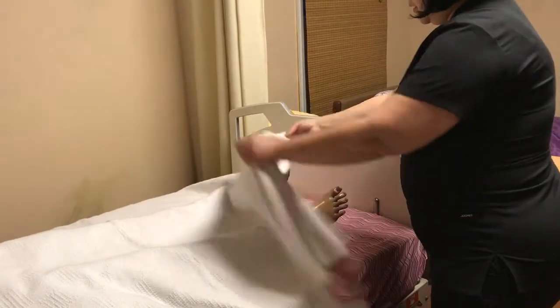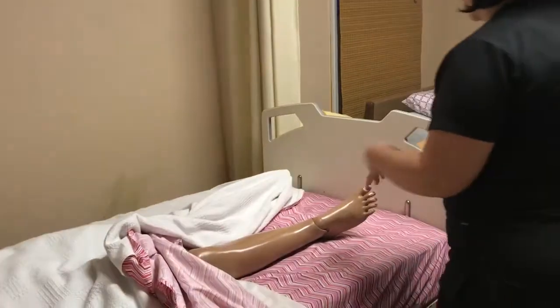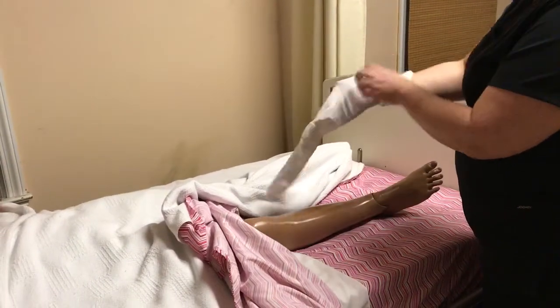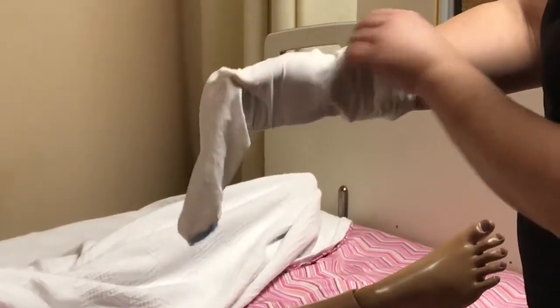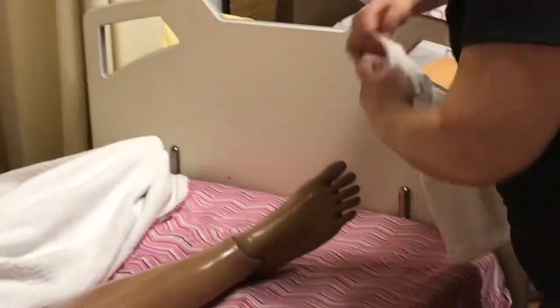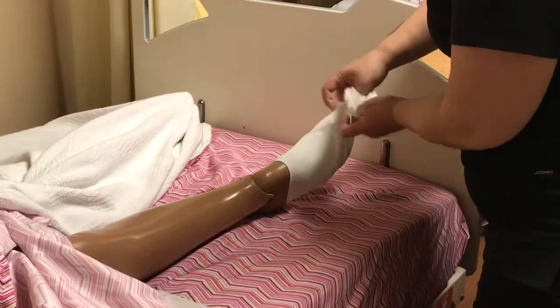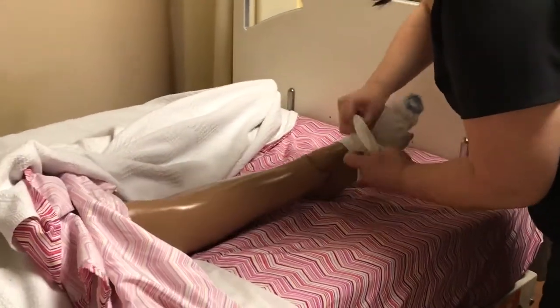We're just going to expose the leg that we're working on and apply the stocking smoothly and gently without causing any overexertion or force to your joints. First thing I need to do is put my hand in and pinch the square to turn the stocking inside out, at least to the heel. Then put this on top of your foot and toes down towards your heel. I'm going to bunch up the remainder of the stocking until we get to your heel.